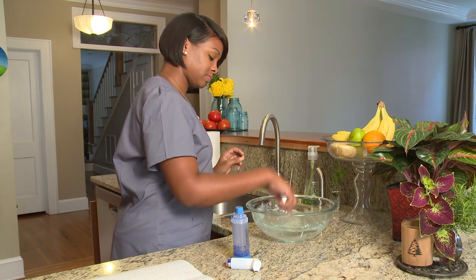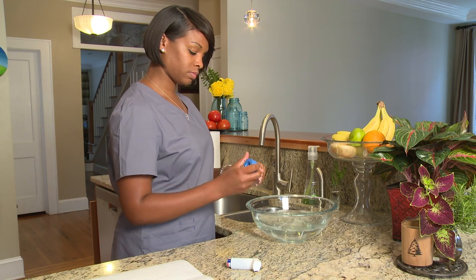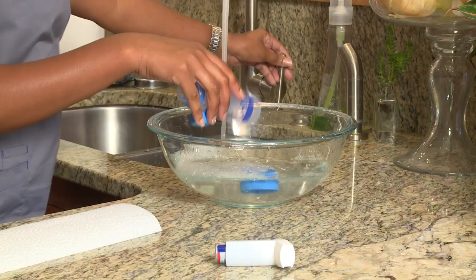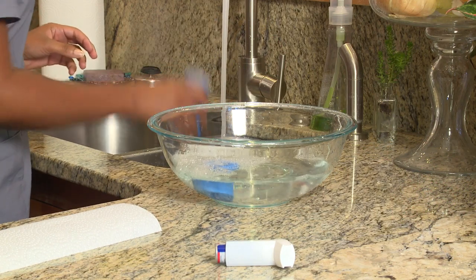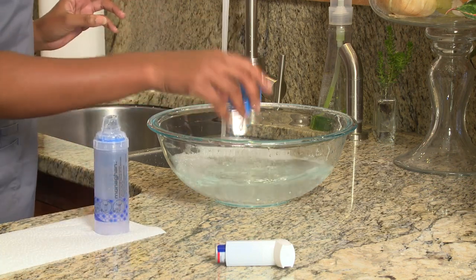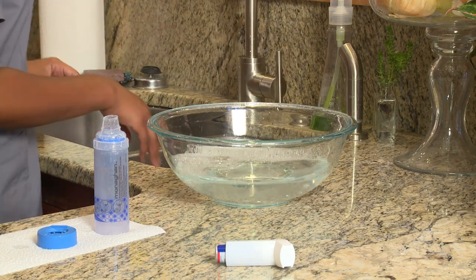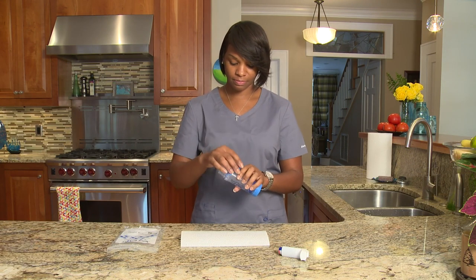Use warm soapy water to clean your spacer once a week to keep it germ free. Start by taking the rubber MDI adapter off the spacer body. Place each part into the warm soapy water and gently move them back and forth to clean them. Rinse the spacer and rubber MDI adapter with warm running water to rinse off the soap. Shake off the extra water and place the MDI adapter and spacer body on a clean dry paper towel. It's important to not use paper towels to dry them — let them air dry. When the spacer and MDI adapter are dry, put them back together for your next treatment.